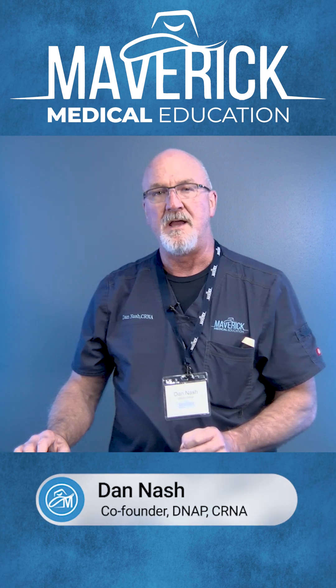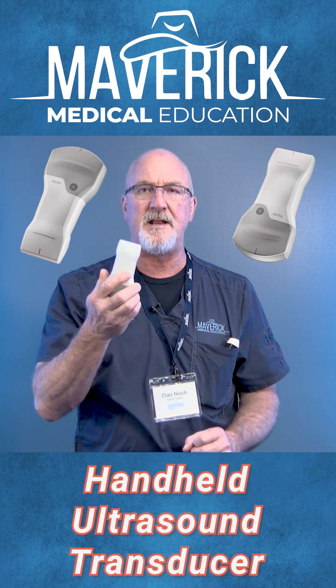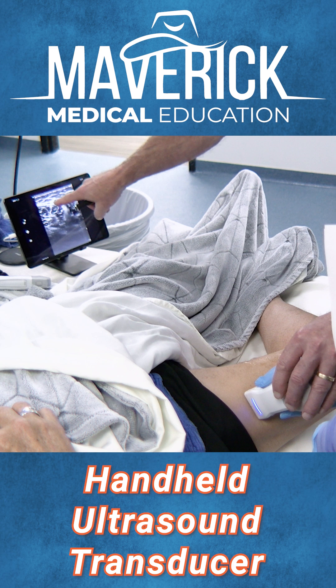Hey Mavericks, this is Dan Nash and I wanted to talk to you about the GE V-Scan. It is a handheld ultrasound transducer that has some really great functionality.